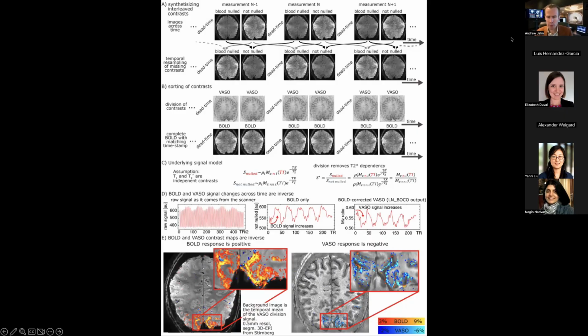And also, if I'm not mistaken, you can combine a gradient echo sequence with VASO, correct? So gradient echo can be more sensitive to certain changes in activity, but VASO can also eliminate these draining veins. Yeah, you can combine them, but I think in general, you can do gradient echo, but the idea is usually when you do VASO, it's because you're trying to get rid of the BOLD effect. Yeah. Right. So if you're going to do that, then you want to do gradient echo, but you want to shrink that echo time so that you can reduce that T2 star dependence.